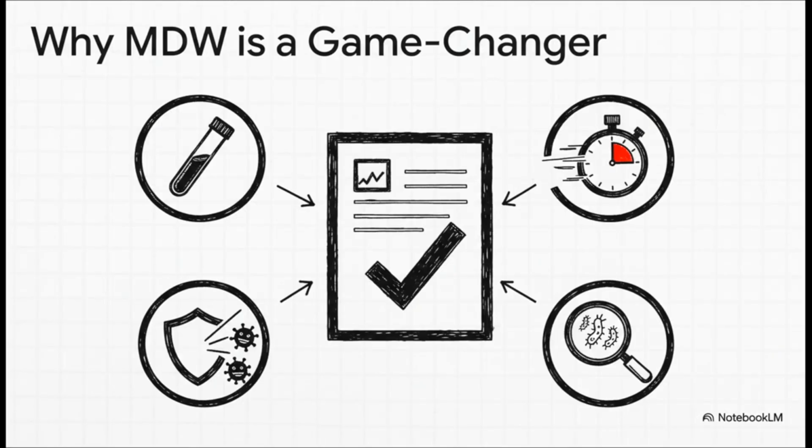So let's just recap why this is such a big deal. It's fast, it's easy, it's already part of your workflow. But the real magic, the reason it's so useful as a screen, is right here in these last two numbers. It's got high sensitivity, sure, but what's really incredible is its excellent negative predictive value. We're talking around 94%. That's what gives you the confidence to start looking elsewhere if the test comes back normal.